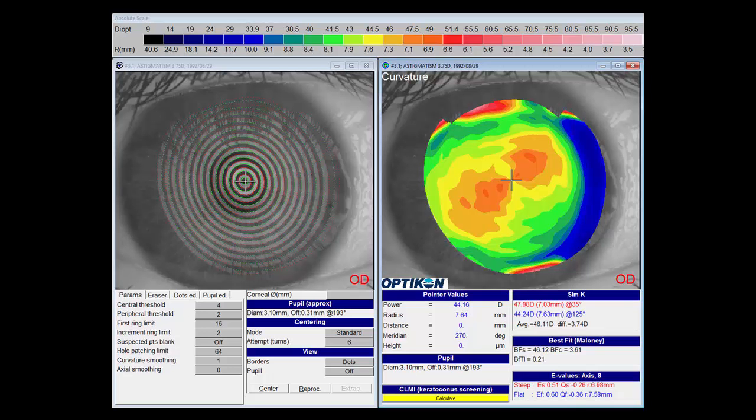Generally speaking, there's no one absolute design that is perfect for every patient, so this video is really meant to provide you with a basic foundation for designing. What's great about Wave is that you now have the power and the capability to create unique lens designs that you never thought were possible when you first learned about contact lens fitting.